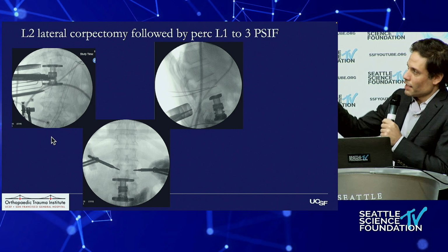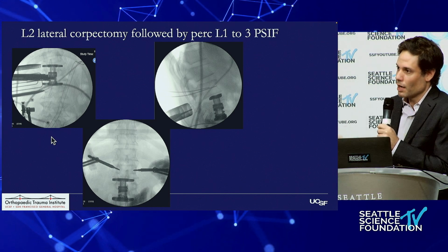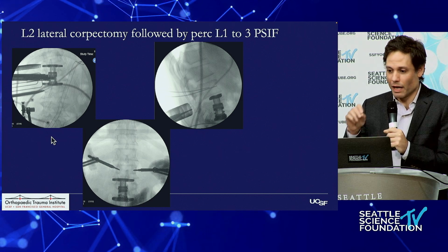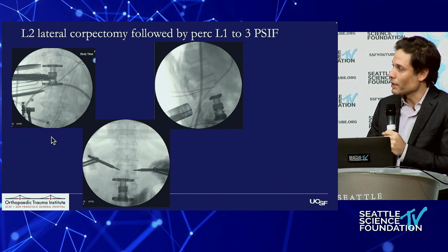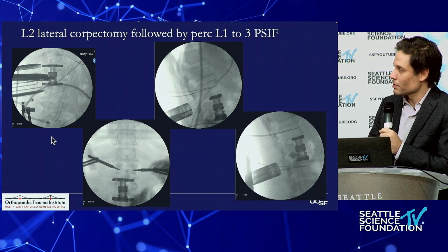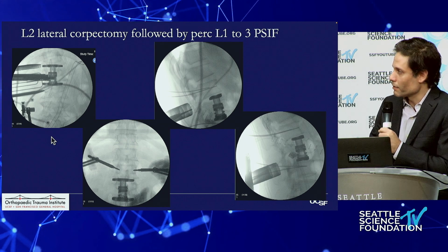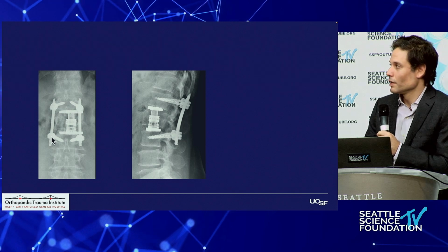So you could see in that picture there, we have the wires down after we've cannulated our pedicles. You drop a tube, set it over the facets, burr it down. You directly visualize the facets as you're burring, and pack it with bone graft. You do that at the 2 levels that we do that for. So again, that's the tube over the other facet. And this was the construct that he was left with.